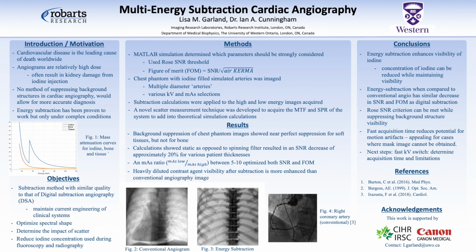This dual energy concept has been proven to be successful previously in our lab, but under very specific conditions, such as using a spinning attenuation filter that outweighed the feasibilities of clinical implementation. The objective of my research is to develop an energy subtraction technique with background suppression similar to that of DSA while maintaining the current X-ray tube design for an easy transition to a clinical setting.